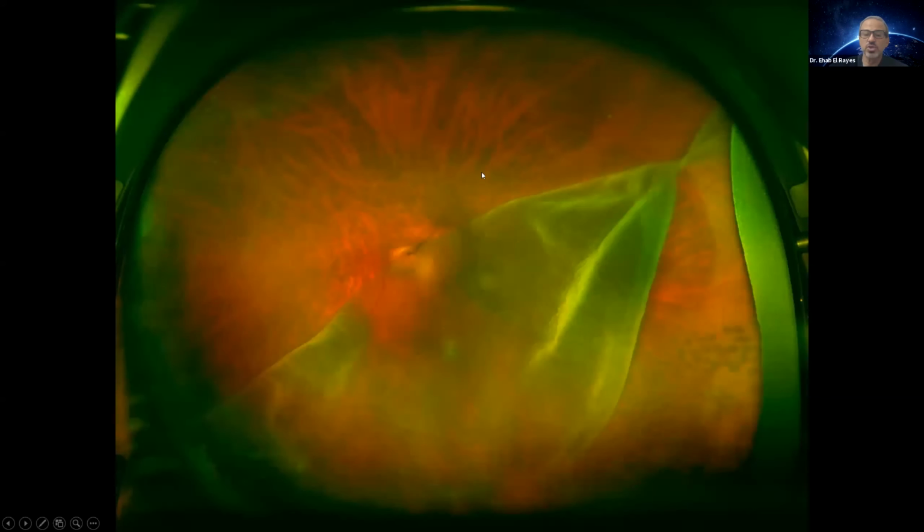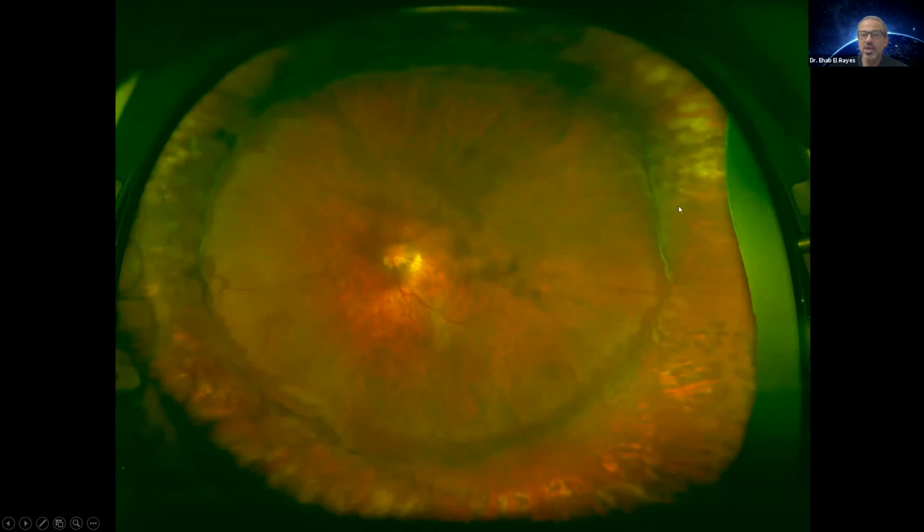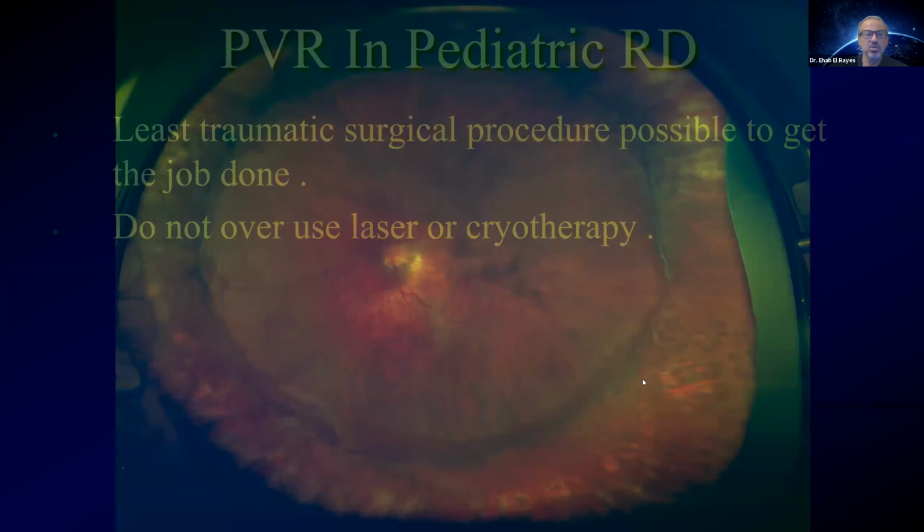Like a patient like this with the giant retinal break, you can fix it with vitrectomy. But I like to see it like this at the end, with a nice buckle supporting the edges here, even the lasered area lying over the supported area. If he develops any PVR at the edge, he is supported and you won't get recurrence early in life.